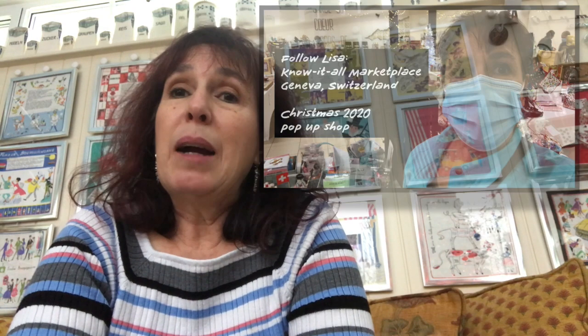We had lockers there, and I had to have a system. We were very fortunate that in our back room we have a sink with cold water. So every time I would go in, I would wash my hands with soap. I would then remove my Invisalign, put them in my locker without touching anything else, then go back and wash my hands again because now I've touched my mouth. I would eat very quickly, have my coffee, do everything all at the same time. Normally I have a coffee at like 4 in the afternoon. I've stopped doing that now, so I have everything at lunchtime. So I only have to take them out 3 times a day instead of 4.